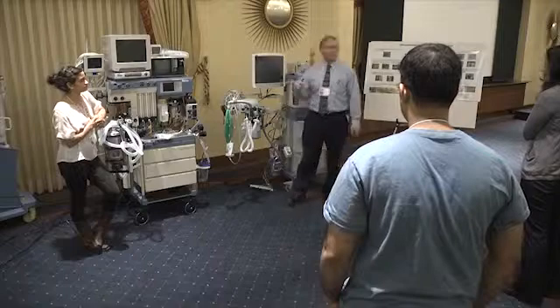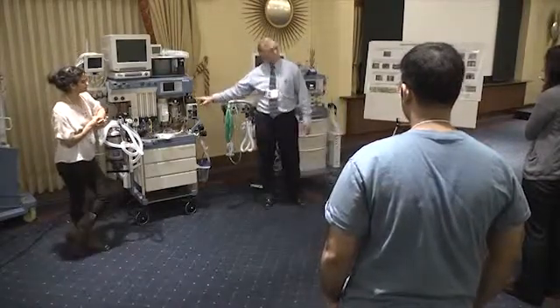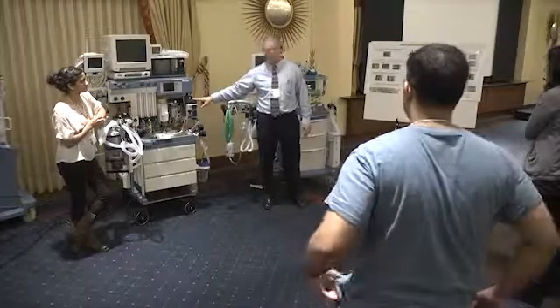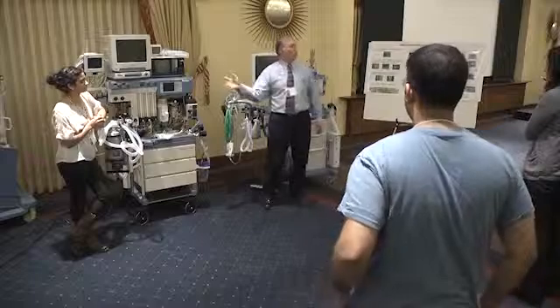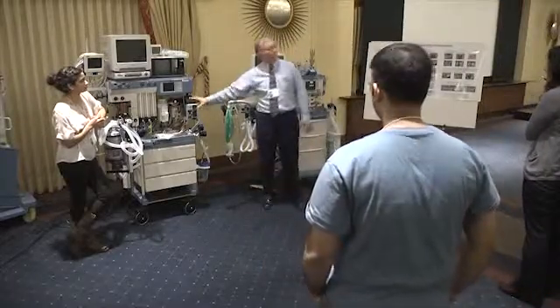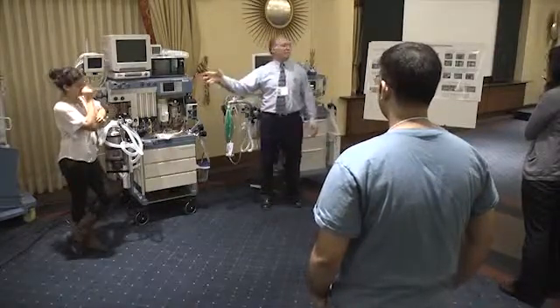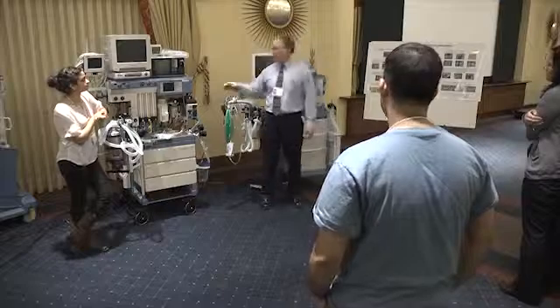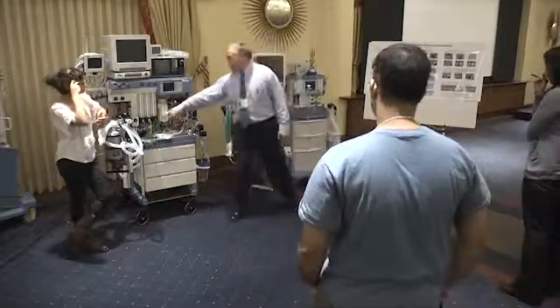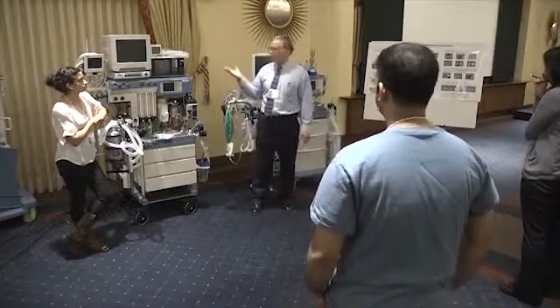And I've had an account where I was just in northern Wisconsin where this exact specific vaporizer was notorious in my account that I've just started into. And they all leaked throughout the whole entire hospital that I was in. 7 of them, 7 ORs, 7 massive leaks, where they could not run low flows. They told me there's a problem with the ventilator. We can only run 2 liters of gas, and we got to set this to 12 all the time. I'm like, holy man. They said, because the bellows, it just doesn't rise up unless we give it 2 liters of flow. It doesn't return to the top of the chamber.